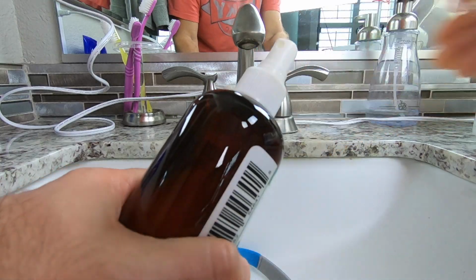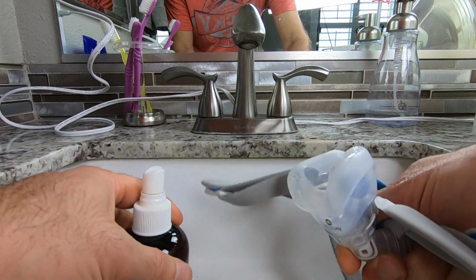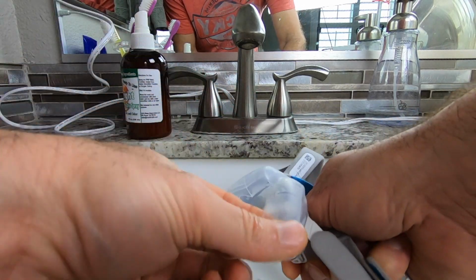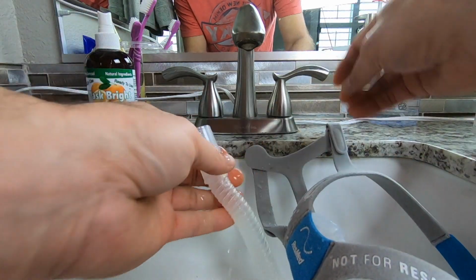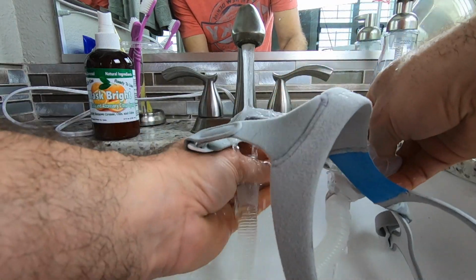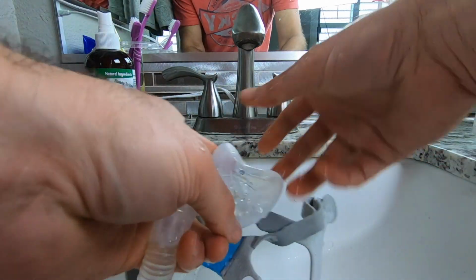So first thing I do is I start by shaking the Mask Bright. You're supposed to shake it. And we give 2 little spritz here. So you can see it's all sudsy. And now I can take this and I kind of work it around. This tubing right here, I can actually spray in there also. And now I just want to rinse it through. Pretty easy. All done, all rinsed. That's all I need to do.